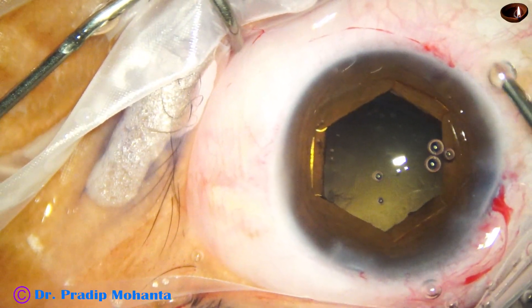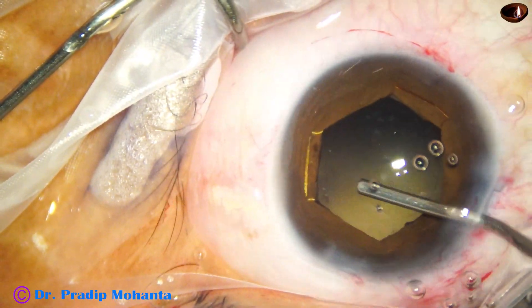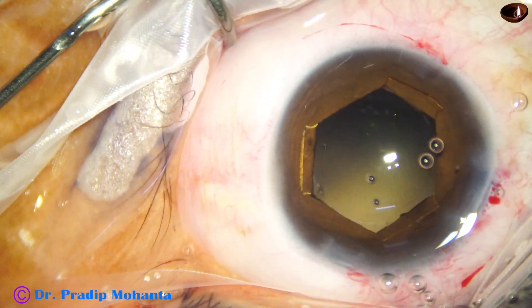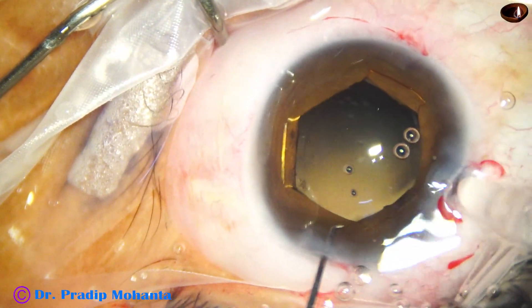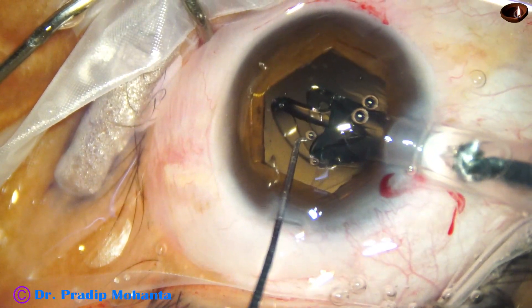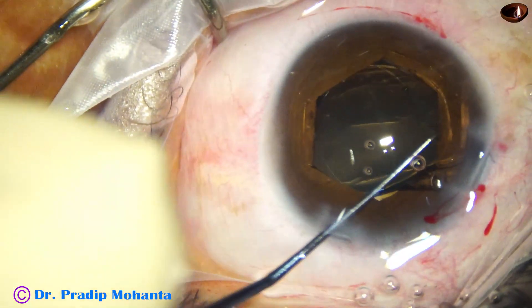And now the anterior chamber and the capsular bag is filled up with 2% HPMC. Then the intraocular lens goes — the lens is injected. This is a hydrophilic, acrylic, single-piece, monofocal intraocular lens.